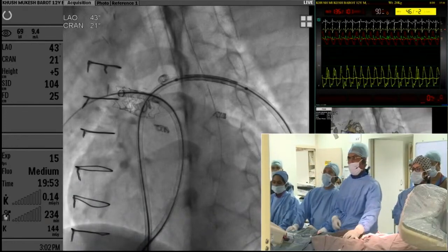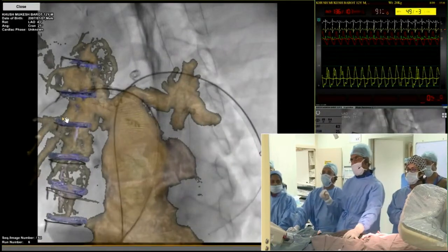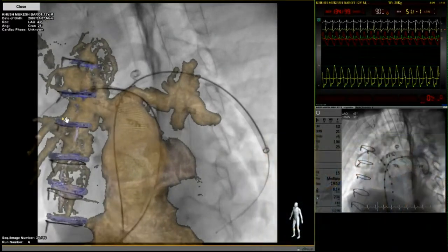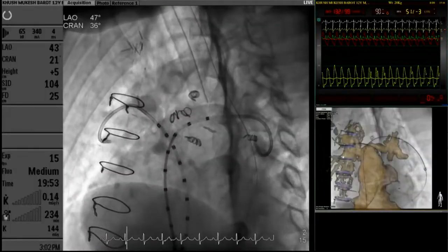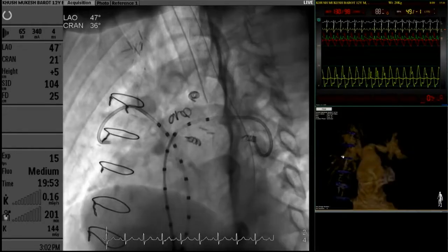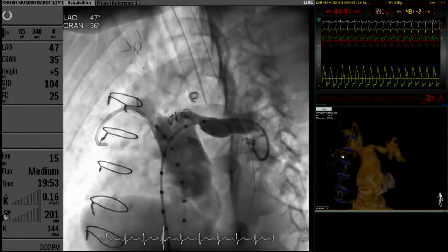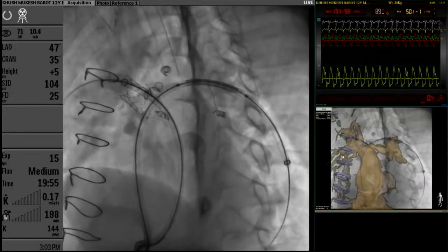Can we overlay the fluoro? Okay, overlay the fluoro. Fine. Now show me the left, what are the metallic markers? Show the original LPA angiogram, and make it bigger. The two clips on the undersurface of the left pulmonary artery will show the beginning, and the coil present in one of the MAPCAs will show the end. Let us try to use these two markers.